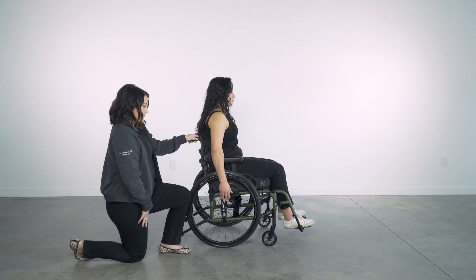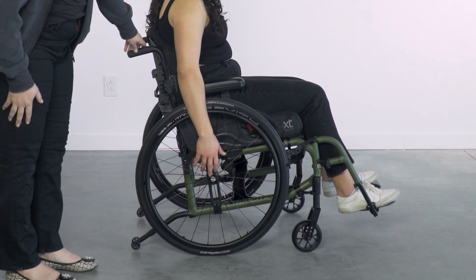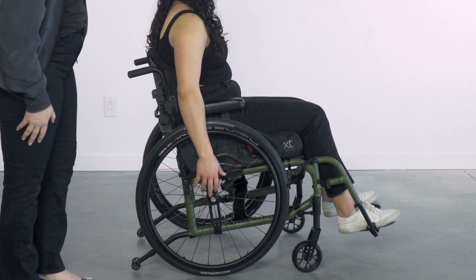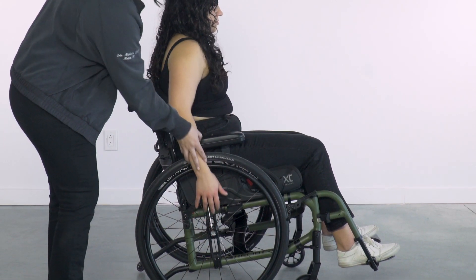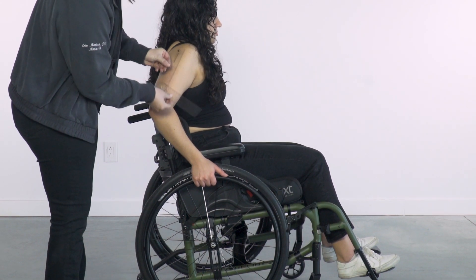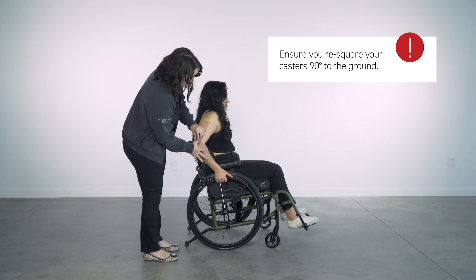When the client's middle finger reaches the axle, verify if this is a proper position for efficient propulsion. Measure the client's elbow flexion with their hand at the top of the hand rim. You are looking for 60 to 80 degrees of elbow flexion for ideal mechanical efficiency.